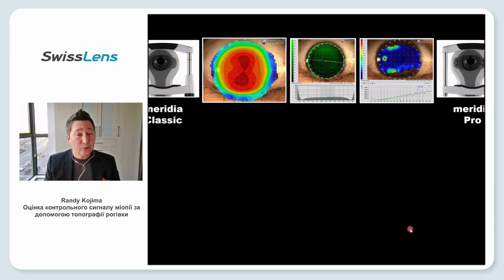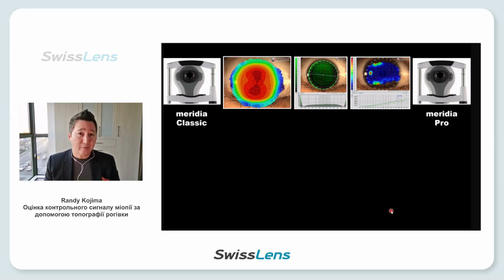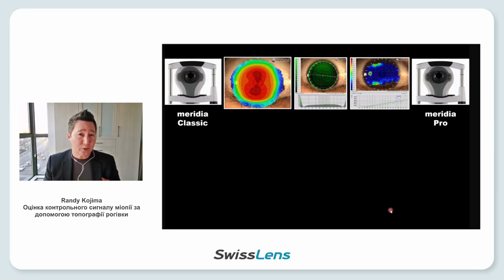They can both use the contact lens software to build lenses. They both have the tear film surface quality analysis, so they can analyze the dry eye measure of the tear film. So both of them are the same in what they share in their topographical analyses.